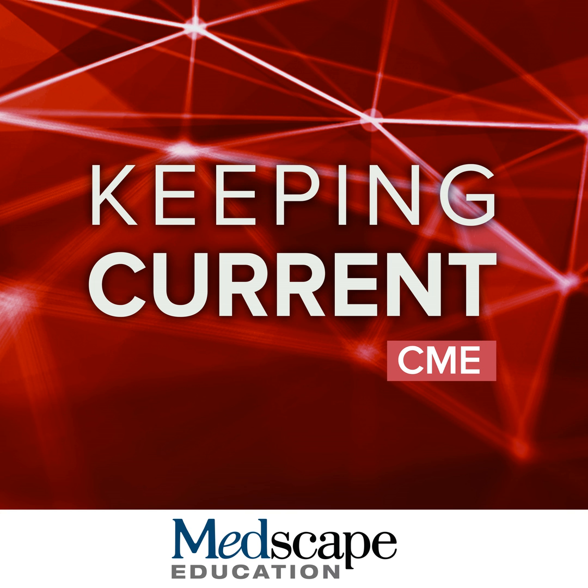So this protocol of cine imaging, inject the contrast, plus delayed enhanced imaging is the basic CMR protocol and addresses most of the indications that you encounter with cardiac MRI.